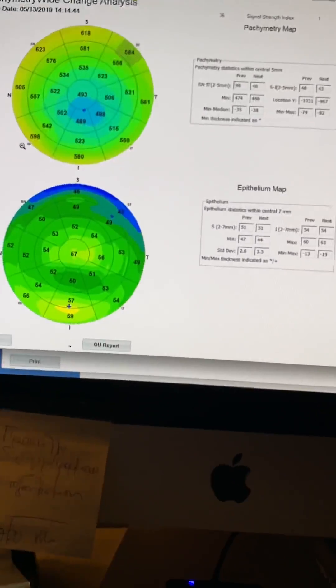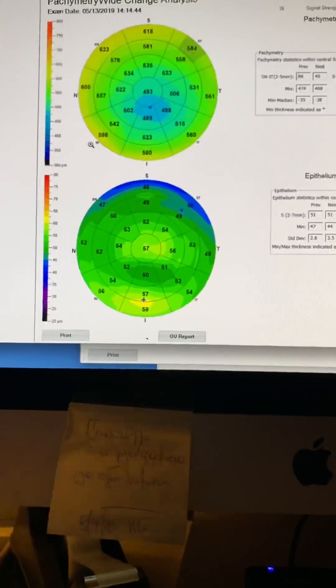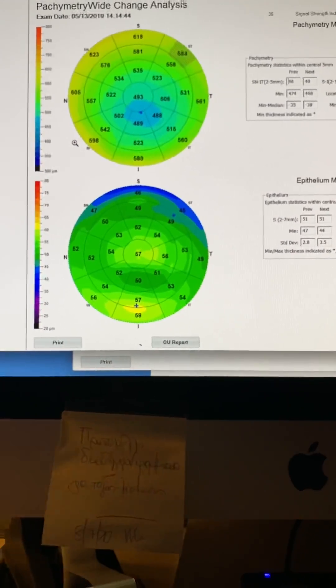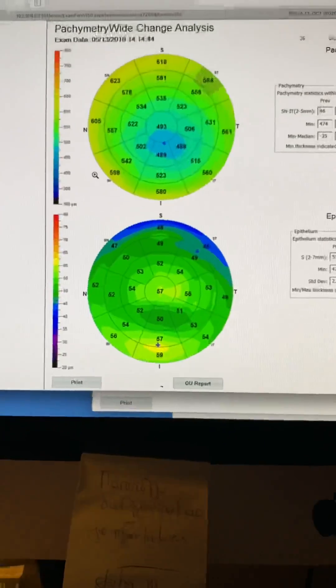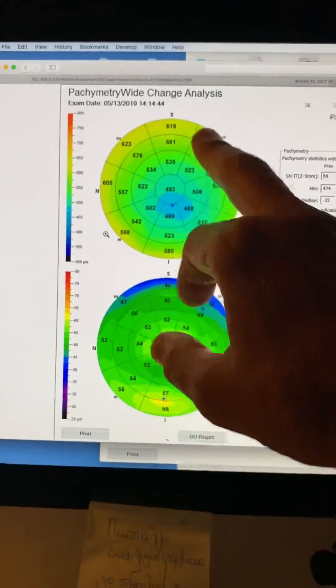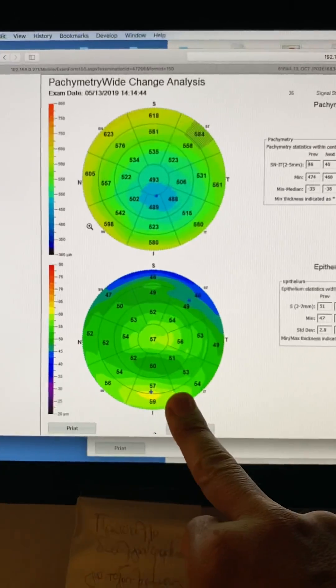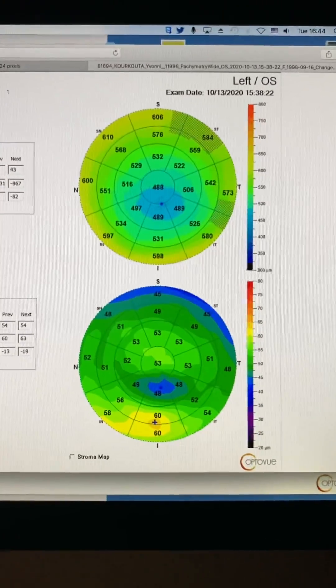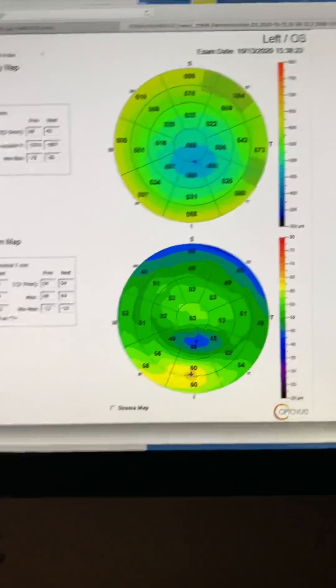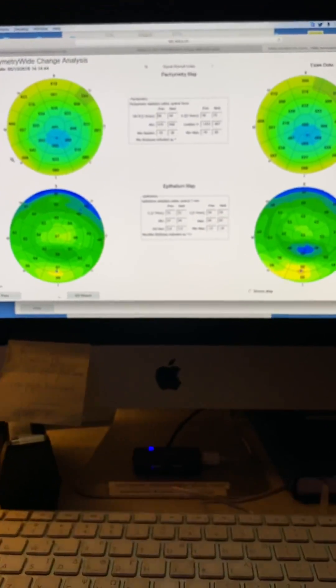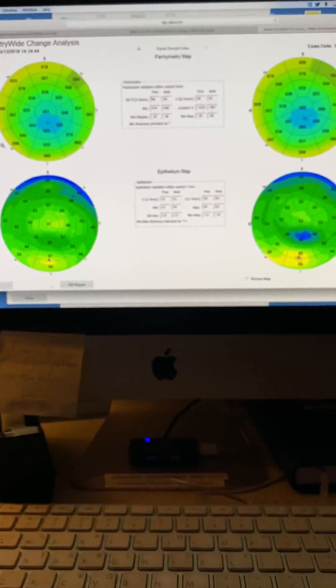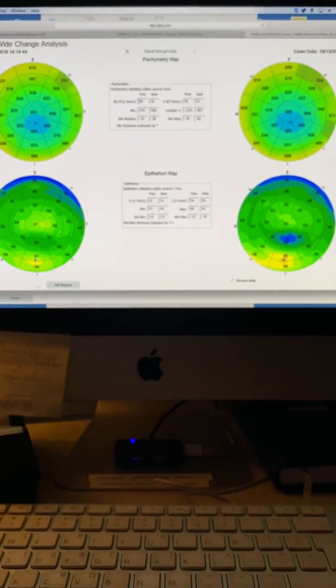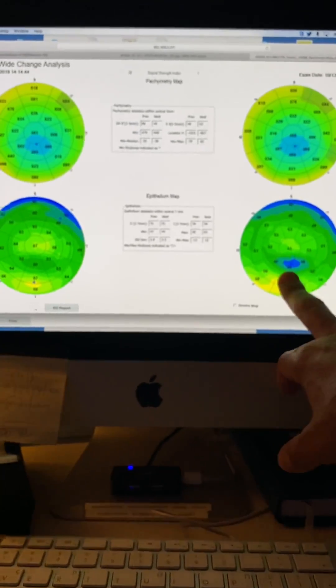And things would be all great if we were not very inquisitive. And we did not check her anterior segment OCT maps. This is the OptoVue Avanti. And this is that same lady imaged with the OCT total cornea thickness epithelial maps. And these are our maps today. And this is compelling evidence that her keratoconus is worsening. And we cannot ignore this clinical finding. The worsening is masked by the epithelial remodeling.